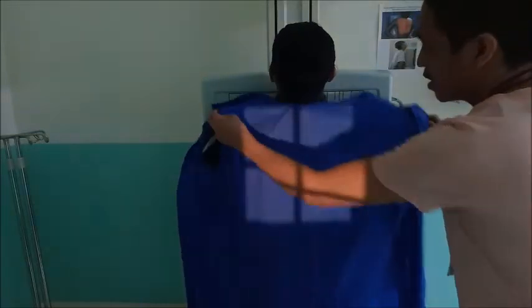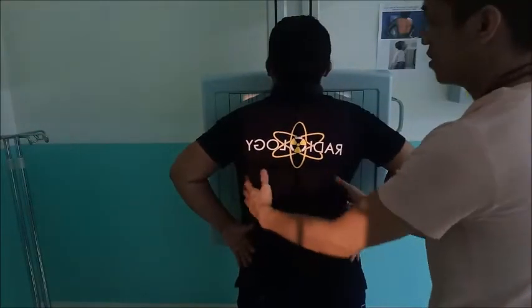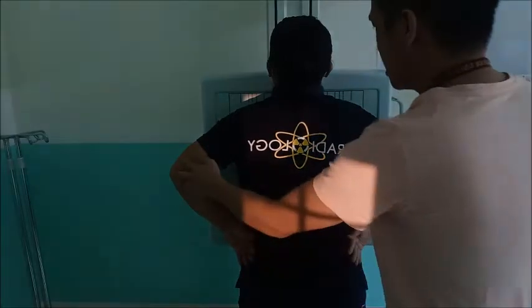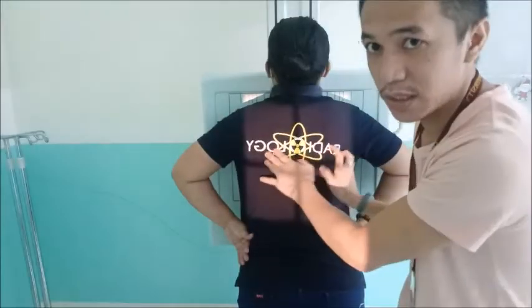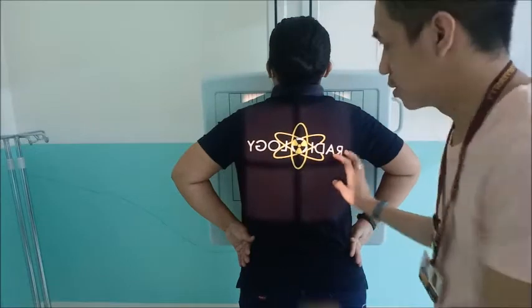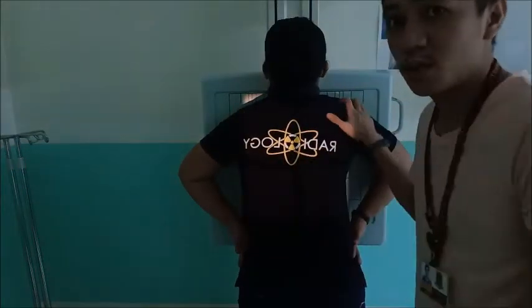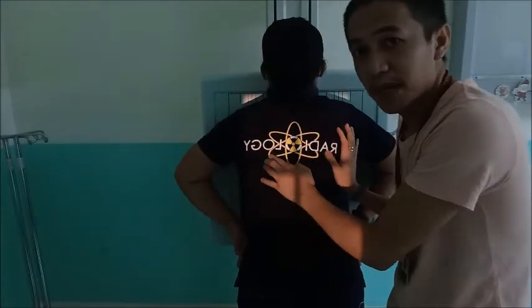The purpose of the patient's hands on the waist and rotated forward is to wing out the scapula, or to project the scapula laterally. So if you push forward or roll forward the shoulder and also the elbow of the patient, you can palpate the scapula.